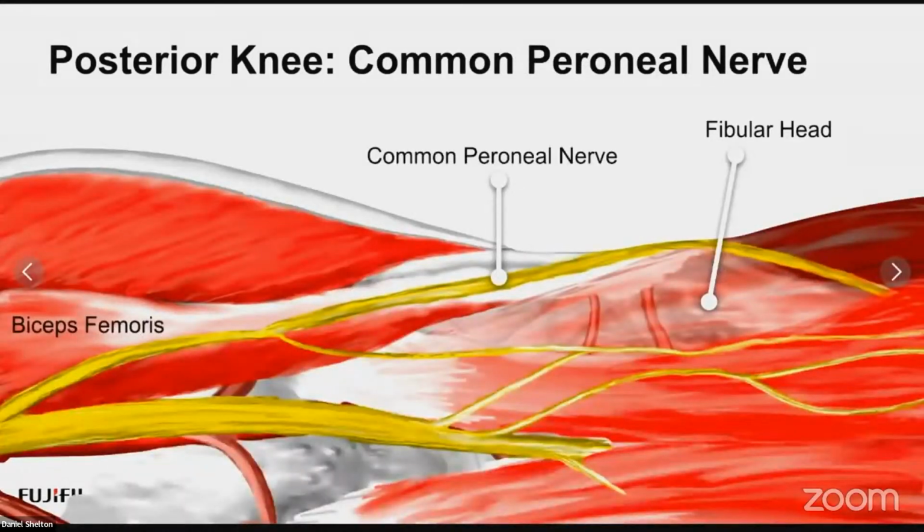So dual screen imaging is not just for comparison, it can actually lengthen what you're looking at nicely. Next structure, let's look at the common peroneal nerve. Went over a little bit of the shortcut on how to identify this in the last webinar, but let's refresh your memory tonight. We're going to identify the biceps femoris. We're going to travel all the way to the fibular head. I want you to palpate the fibular head with both of your fingers and pinch it between your fingers. Set the transducer right between your fingers, and it should land you on the fibular head in one striated structure.